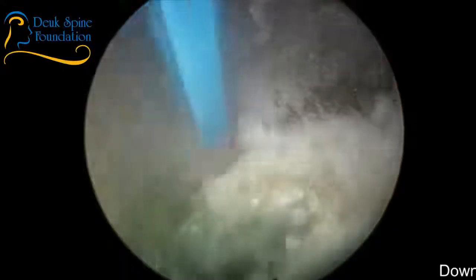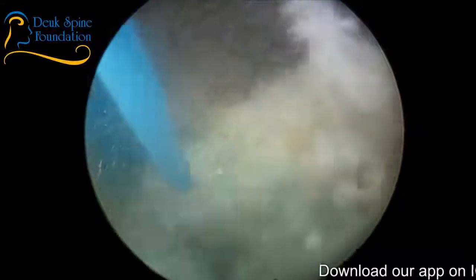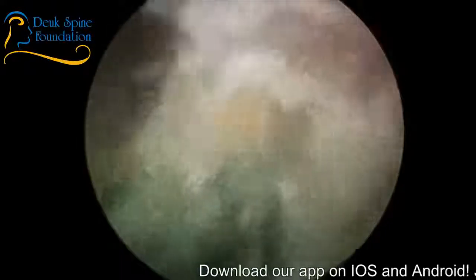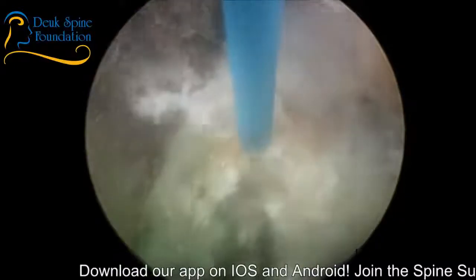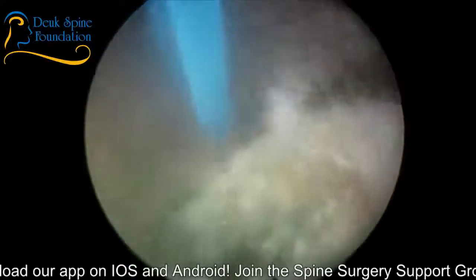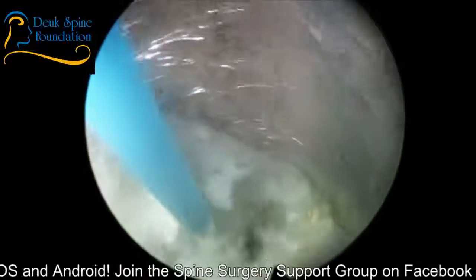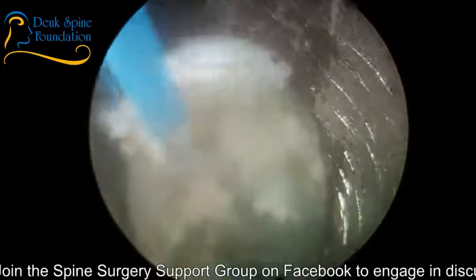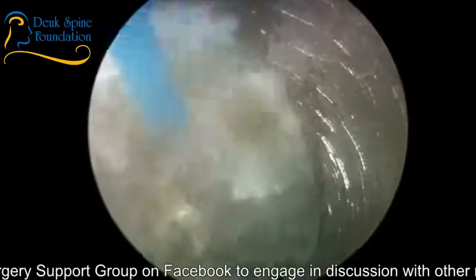Could this patient have had the other surgery with a fusion? Yes, but he didn't want to. He wanted to try to fix this problem without doing open surgery, without doing a fusion. I felt that we had a good chance of getting these herniations fixed with the laser, endoscopically, and that's why we decided to go this route. Ultimately, I don't tell patients what surgery to have done. They choose. I give them the pros and cons of each way, and they decide what they want for them. Everybody's situation's a little bit different.